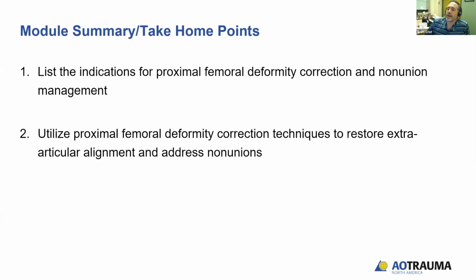And then I have another question about orthogonal plating for maybe some of the intertroch osteotomies for intertroch fractures, or the time that I can think of is an atypical femur fracture nonunion, when I would consider orthogonal plating. But when do you guys consider using orthogonal plating?